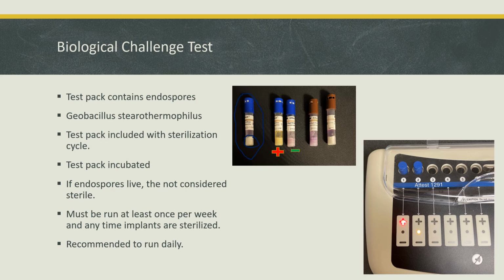If you're running some implants that you're going to be using for a case, you'll need to hand this off to the circulator after you get the instruments to your back table. But let it cool just a little bit first before you close that top, and then drop it off to the circulator, so it doesn't burn their hands when they take it.